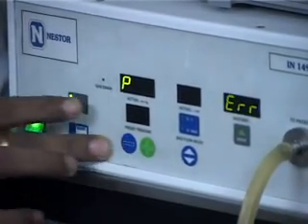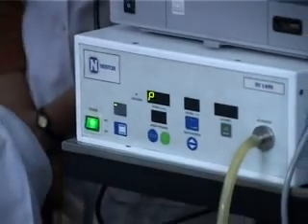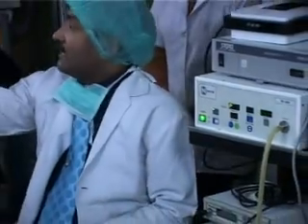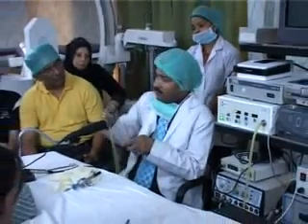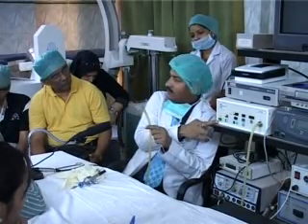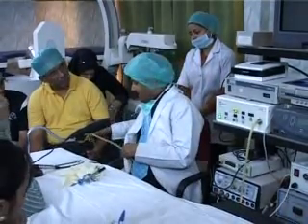It is blocked, and it is giving you an error. Why is there an error? Because you have not evacuated the air which was present in it, and this is a safety feature. So now what you have to do? Disconnect the insufflator, switch it off, and then switch it on again. And now if you feel, it is expelling the air.